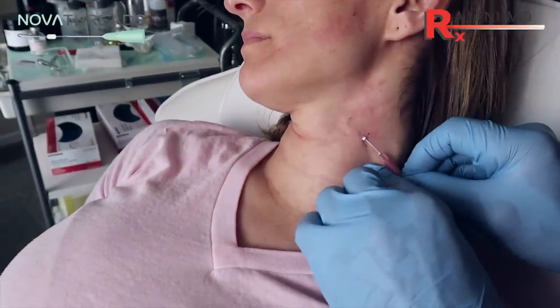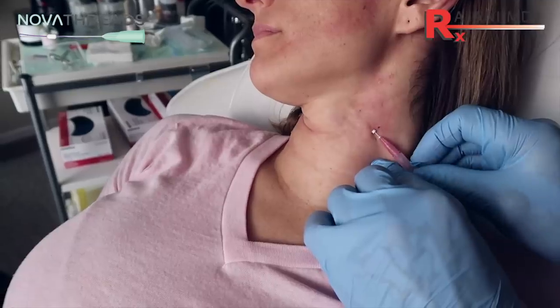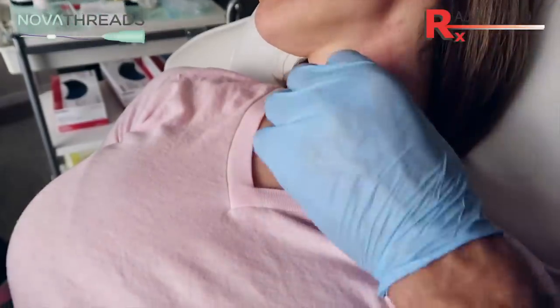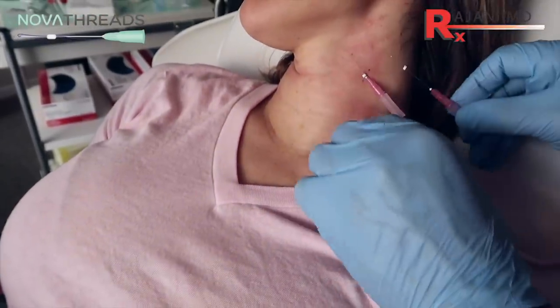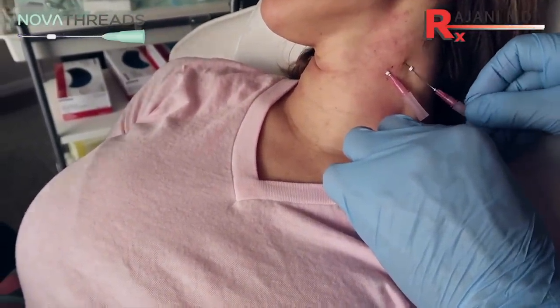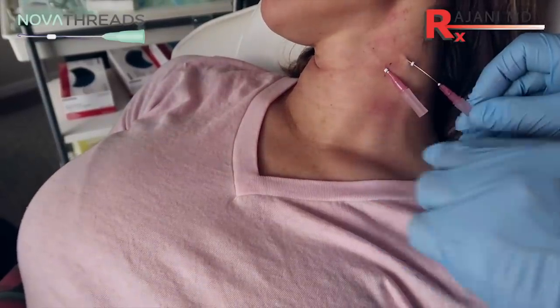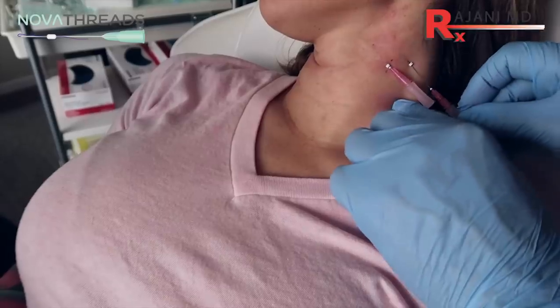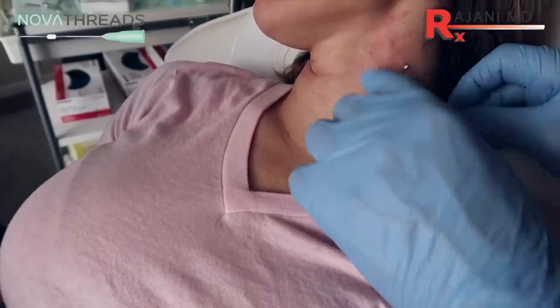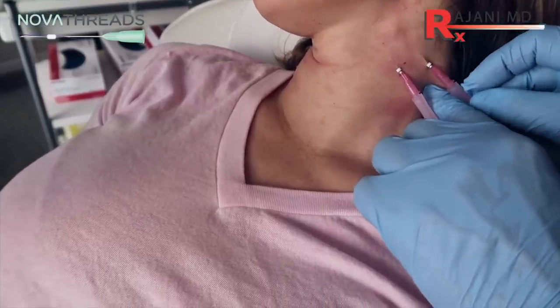If collagen loss occurs, we're preventing that, but we're also treating what's there now. I'm always adjusting the depth — if I see it go superficial, I'm counter-tractioning; if I see it go deeper, I'm flexing upwards. It's where the tip is: flexing down, the tip goes superficial; flexing this way, the tip goes deeper. And then manipulating the skin each time to move the skin where we want it.